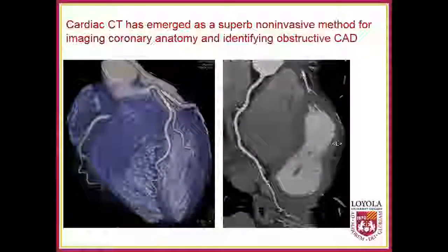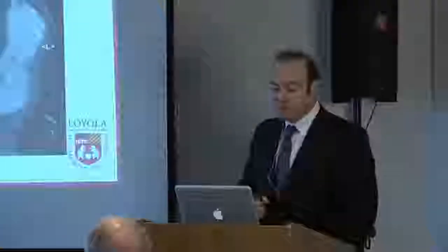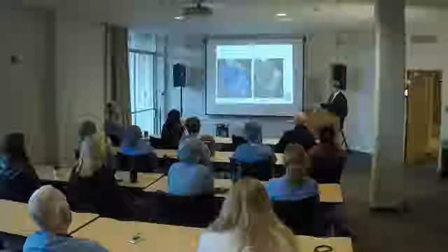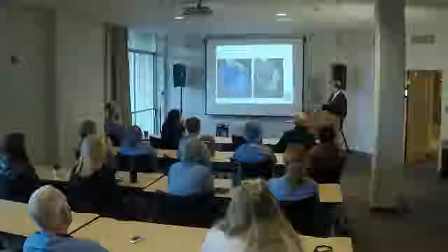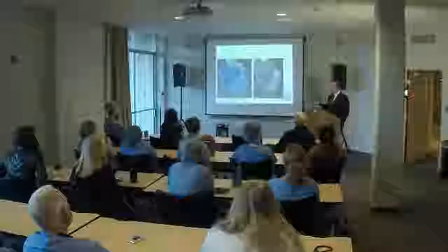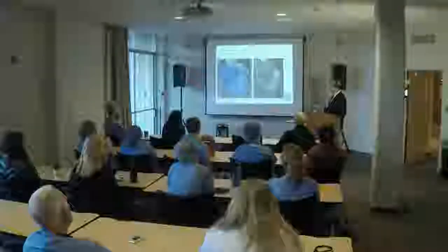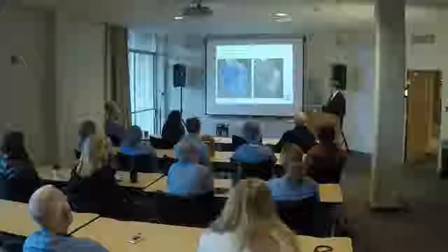CT is a superb non-invasive imaging modality to assess for stenosis in the epicardial coronary arteries. This is an example of what we call a three-dimensional volume rendered image of the whole heart. You can appreciate the exquisite detail, spatial resolution. This is really fantastic for identifying origins and courses of coronary arteries. I don't really use these 3D volume rendered images to assess stenosis, but it gives you a nice lay of the field of what to expect.